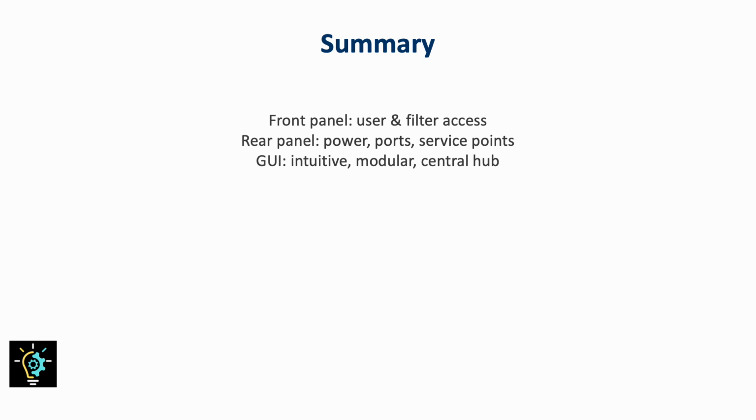The PB980's panels, front, rear, and GUI, are designed to balance usability for clinicians and serviceability for engineers. The front gives immediate access to filters, sensors, and displays. The rear takes care of the backbone: power, connectivity, and expandability. And the GUI brings everything together in a central hub that's intuitive and reliable.